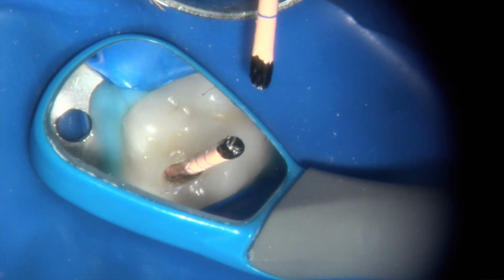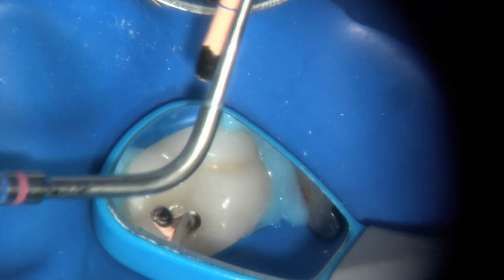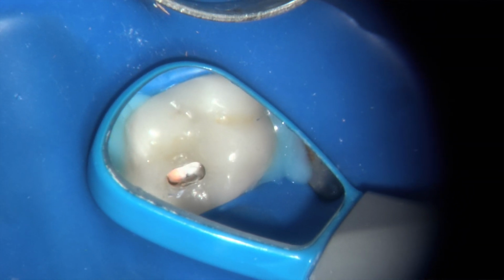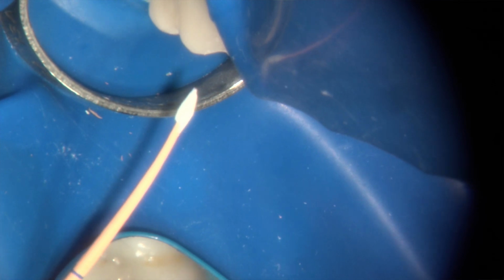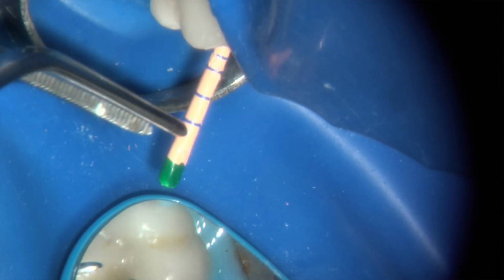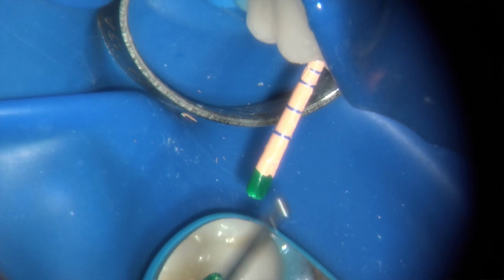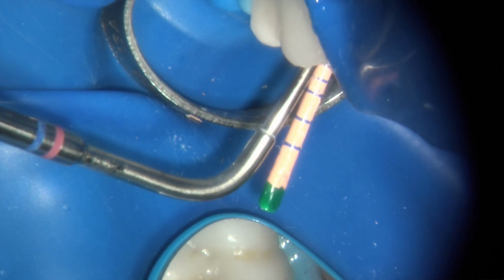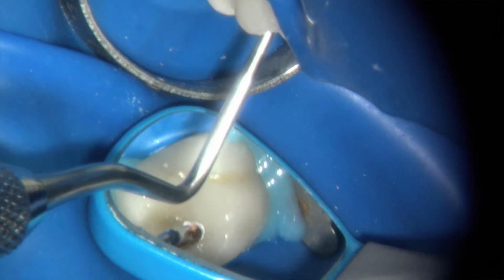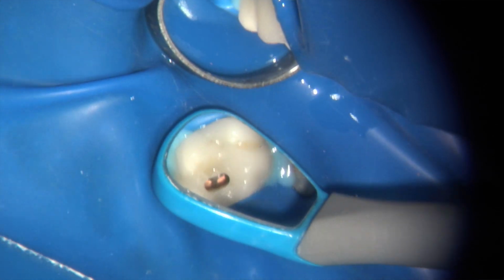I'm also then using hydraulic condensation in it, and the tip that you just saw is actually a new tip that I've designed. It's not yet on the market. We're in the process of making it, and this tip, as you can see, makes the idea of hydraulic condensation a much easier and much more efficient process. Once the coronal portion of the MB1 has been cut off, we do the same exact thing with the MB2, and then insert that also into the MB2 canal, making sure that it goes all the way down to the apex. Now that is seated too, and we do the same process of hydraulic condensation with the MB2, and then plug that down. Now what we've done is actually obturate the root canals with the concept that the apical 3 millimeters of these canals have been filled with the putty fast set combination.